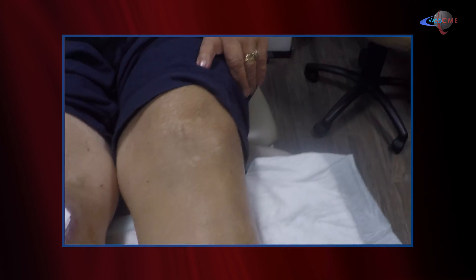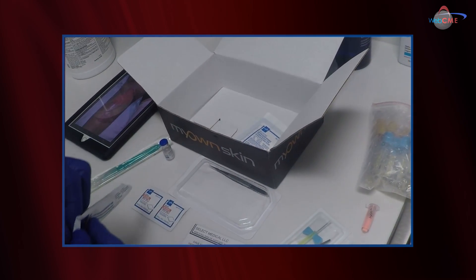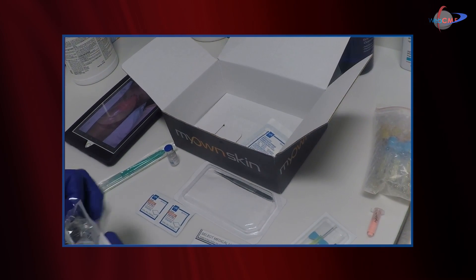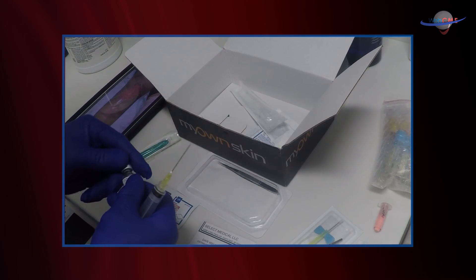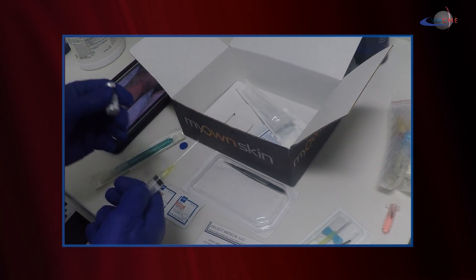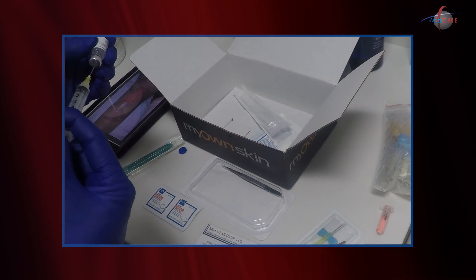What needs to be accomplished is we need to take a little skin specimen that will be sent to the lab, as well as a blood specimen. The kit comes well equipped with just about everything we need to accomplish that. I'm going to get a little skin biopsy. The kit does come with some lidocaine, and we'll draw that lidocaine up. I'm going to harvest the skin sample right from the patient's arm.